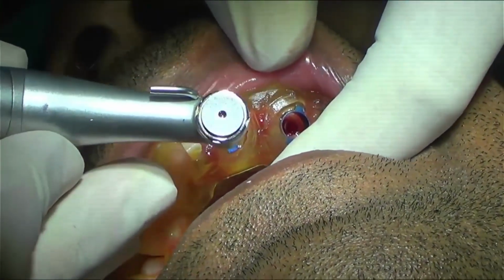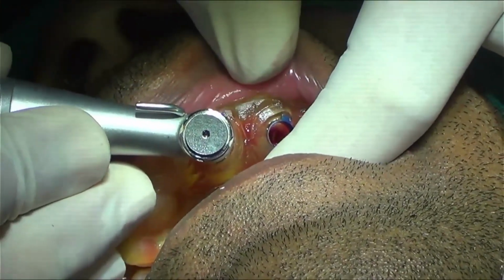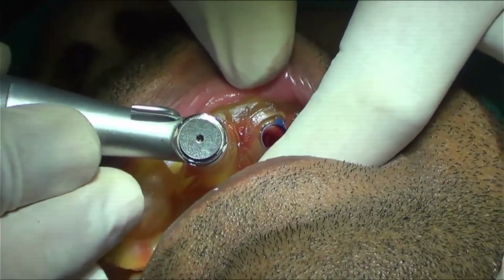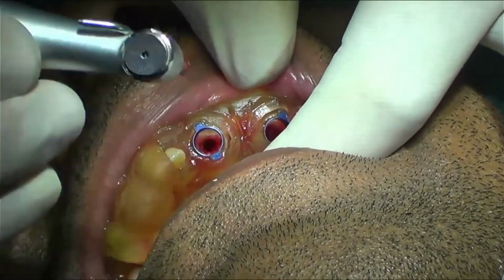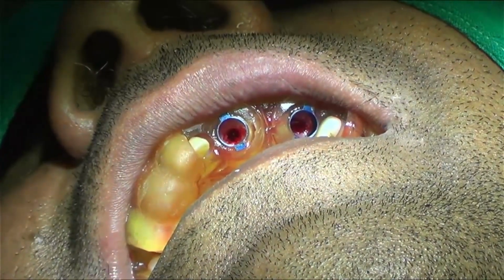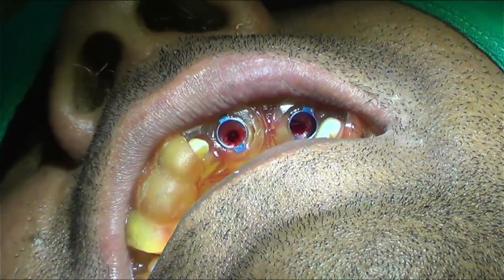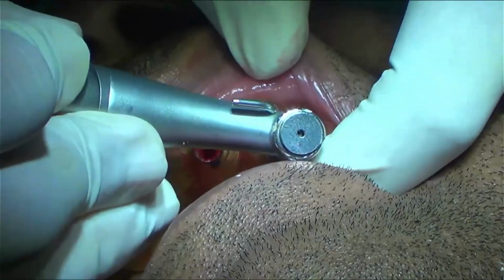But if I take my drill inside, engage the osteotomy, then stabilize my drill, and then start, there are very, very few chances of actually achieving any deviation. So this is the next.